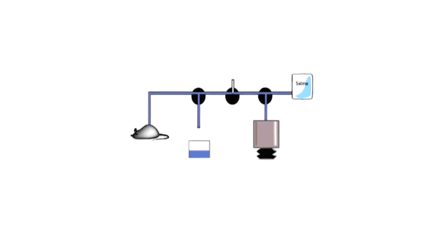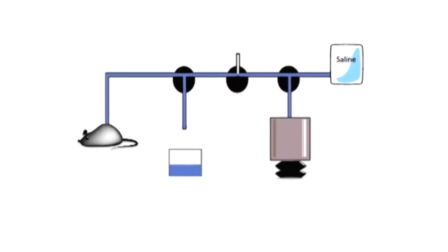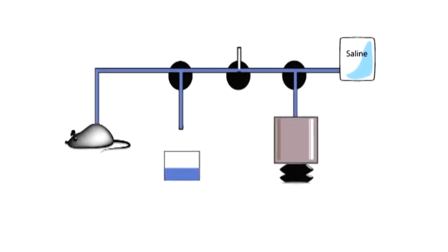The AccuSampler uses a technique where air bubbles in the tubing system prevent the blood from mixing with the saline solution. With the AccuSampler standard, it works like this. Blood is taken from the animal. An air bubble is positioned in the tubing system. The blood sample is set in position between 2 air bubbles and can now be moved in the tubing without mixing with saline solution. The blood not needed for the sample is given back to the animal. And the blood sample is collected in a vial.